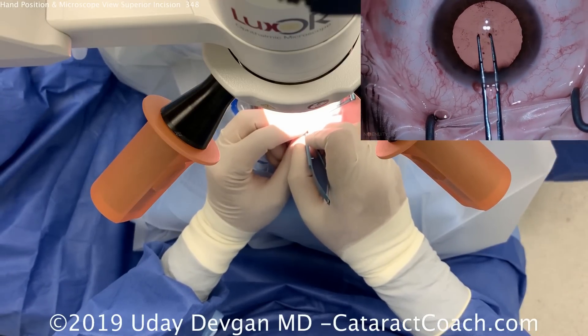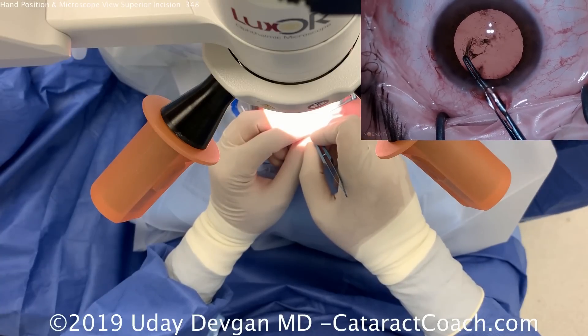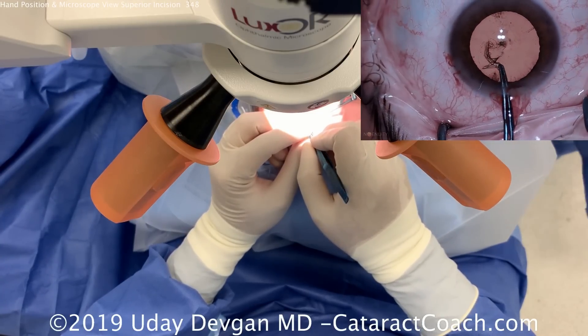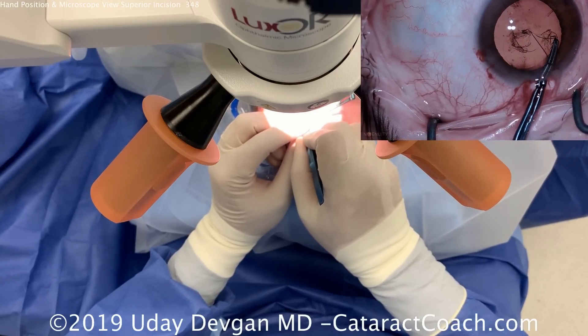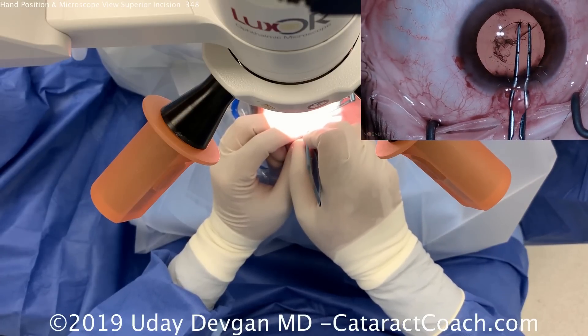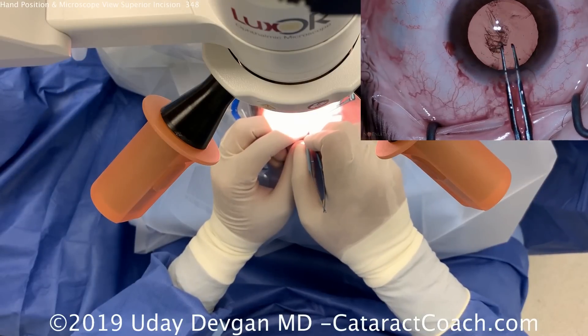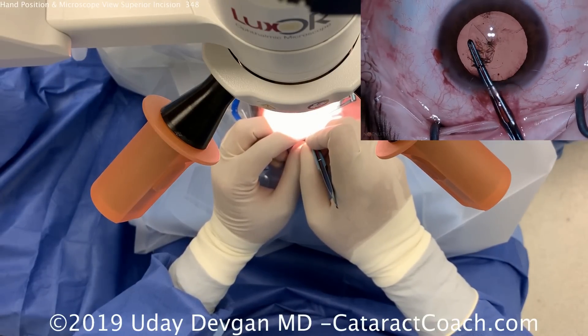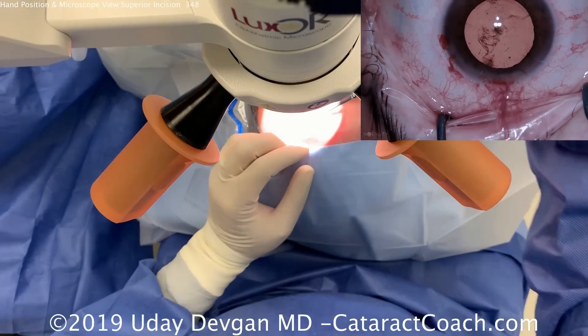Capsulorrhexis forceps are going into the eye and we're going to tear around the capsulorrhexis. Look outside the eye at the hand — the right hand is doing all the work, with pivoting to float within the incision. The left hand is just providing some support and doesn't need to be used much. If the patient had difficulty with fixation, we could use the left hand to stabilize the eye by hooking the paracentesis with a second instrument.